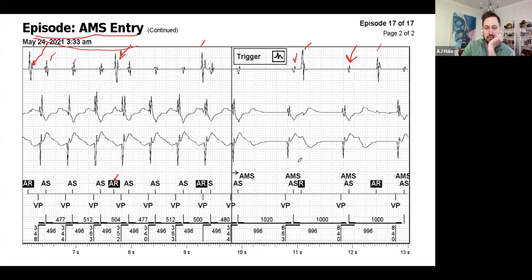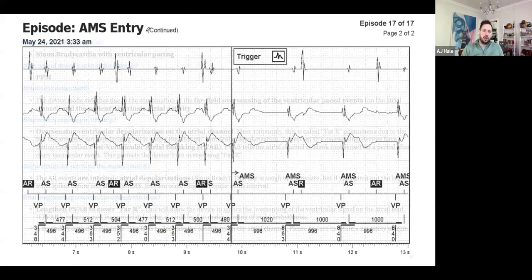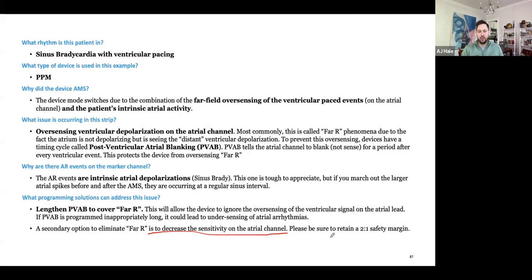What can you do to address this issue? You can lengthen PVAB to cover the far-field R wave. You can also decrease the sensitivity of the atrial channel, but be aware that if you raise that threshold too high you may block out the intrinsic atrial events — the device is no longer able to track. Obviously this is an EGM, but it's much easier to see live because then you can modulate the rate. If you see atrial events continue to occur one-to-one based on your ventricular rate, this indicates far-field R.